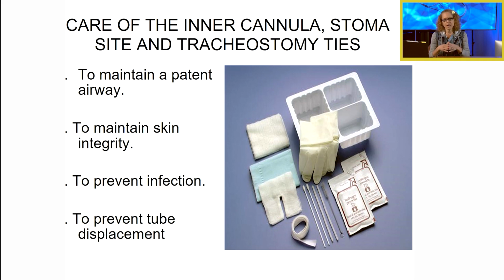Okay? The important thing when you're doing either trach suctioning or trach care is, number one, to realize that the patient might need to be oxygenated supplementally in between your suctioning, with probably an ambu bag at the bedside. The other thing you want to remember when you're doing any type of suctioning or trach care is to be very gentle with the trach and make sure that it is not dislodged, because remember, once that trach tube comes out, the airway is no longer open.